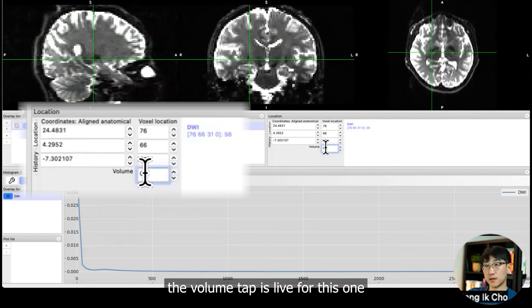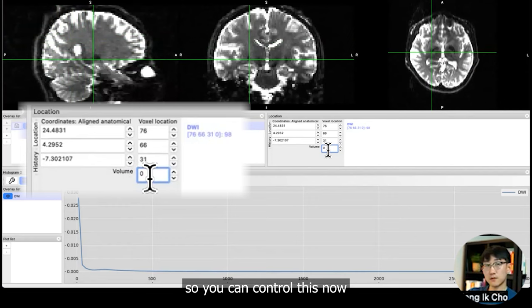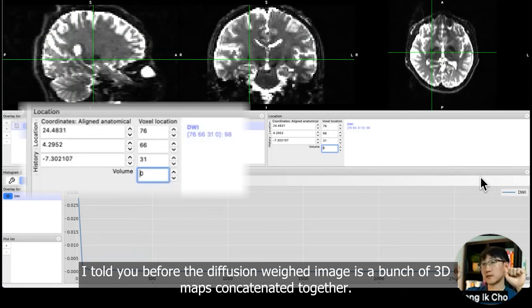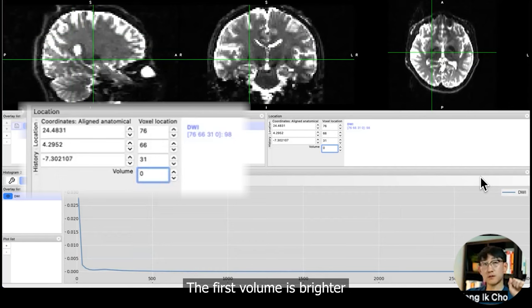One thing to note is that the volume tab is live for this one. For T1 maps, this was locked so you couldn't control this. So now you can go to the next map.